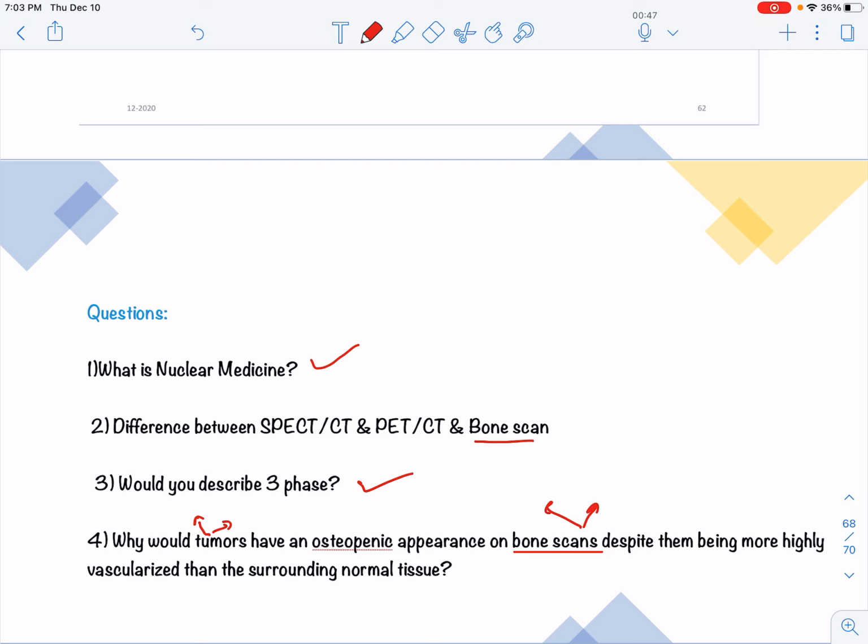In PET, actually, it detects the osteolytic region, but in bone scan it detects more the osteoblastic region. And as we already said, if we have hemangioma, there are many kinds of tumor; some of them will have higher uptake and others will not. So it depends on which kind of tumor and which kind of modality we are using.